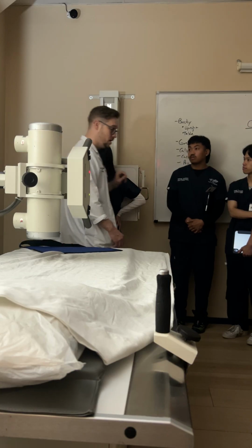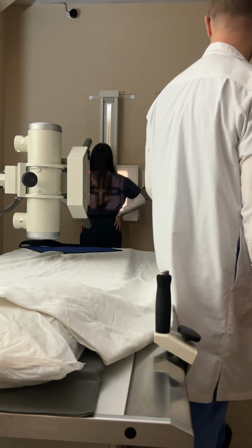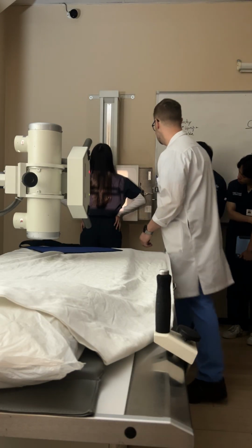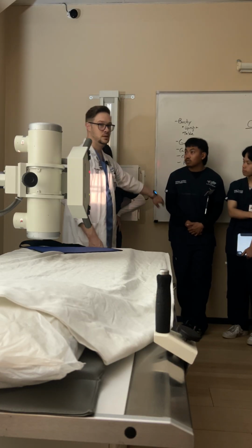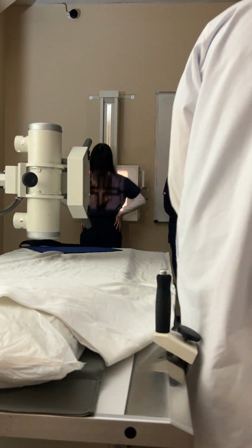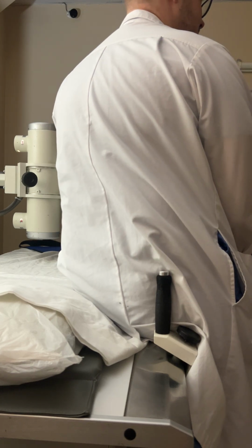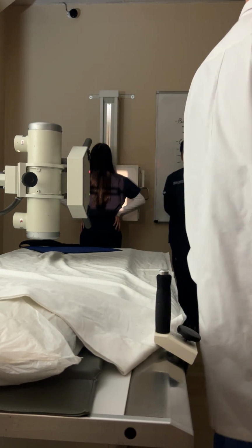The top of the cassette should be about 2 inches above the top of the shoulder, which, again, she's tiny, so that's why I collimated in even further, okay? Also, that's when we use a collimation. Mm-hmm. Yep, you got it. For a larger, more average sized adult, no offense, Victoria, you could probably keep the collimation open a little wider, okay? Can I have somebody open that door for me?